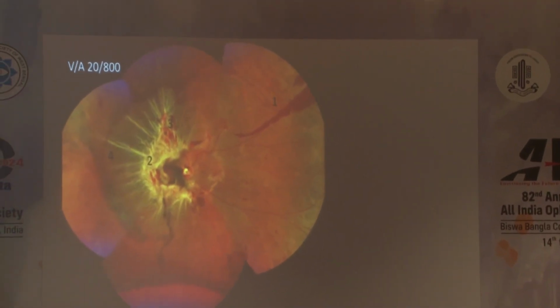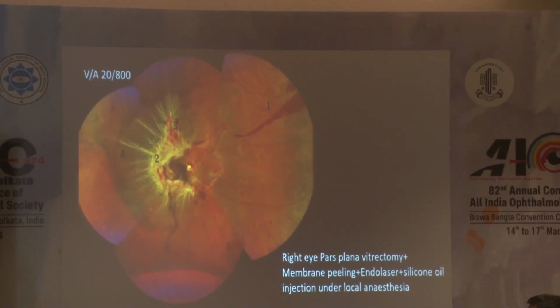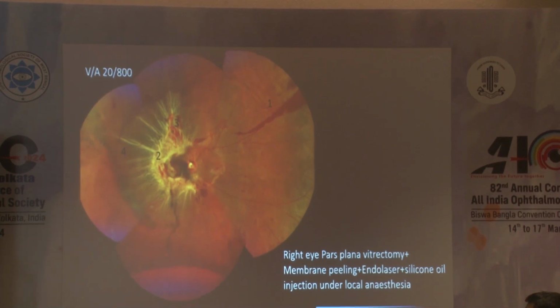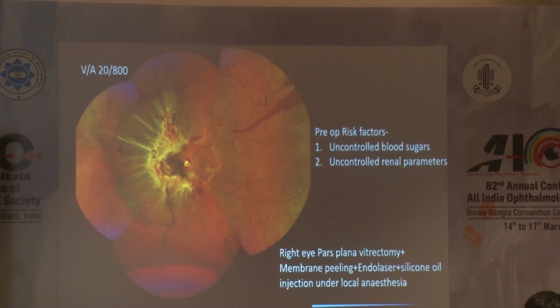suggestive of right eye combined retinal detachment. He was planned for right eye pars plana vitrectomy with membrane peeling, endolaser and silicone oil injection under local anesthesia. But the preoperative risk factors before going ahead were uncontrolled blood sugars and uncontrolled renal parameters.